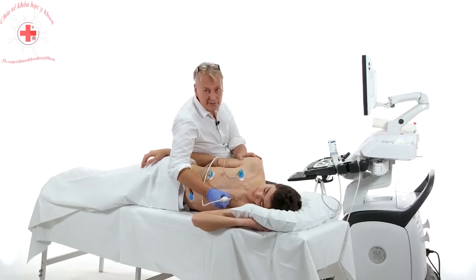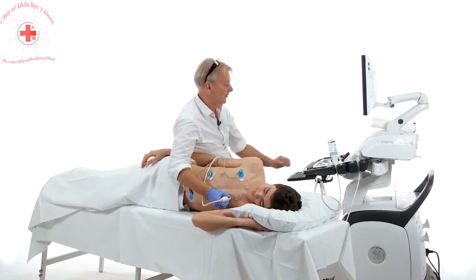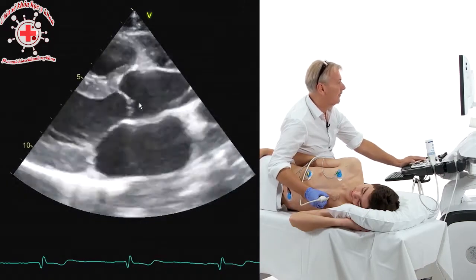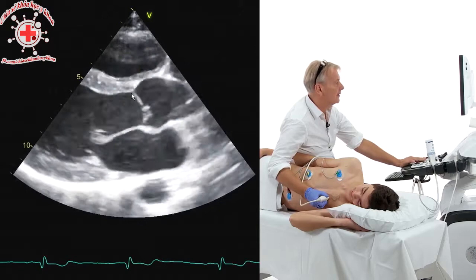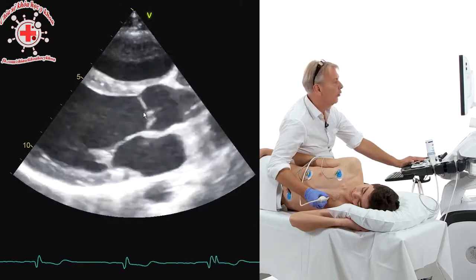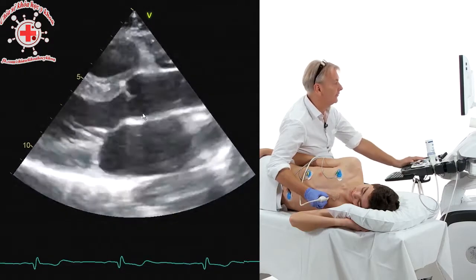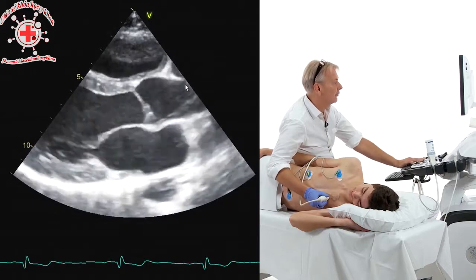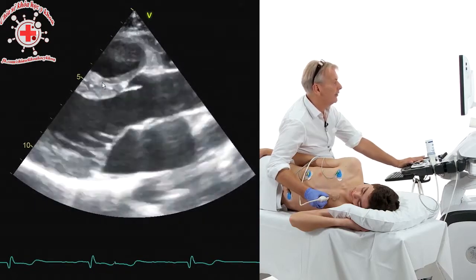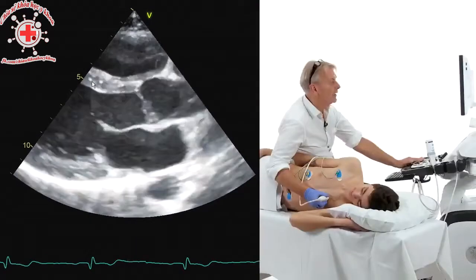Now, the image quality here is really superb, so you can see even very detailed and small structures. What do we have here? Well, we have the aortic valve. This is the right coronary cusp, and this could be either the acoronary or the left coronary cusp. It depends very much on how we angulate the transducer. We have the ascending aorta here. This is the right ventricle, the myocardium. Observe that we can even see the speckled appearance here in the myocardium.